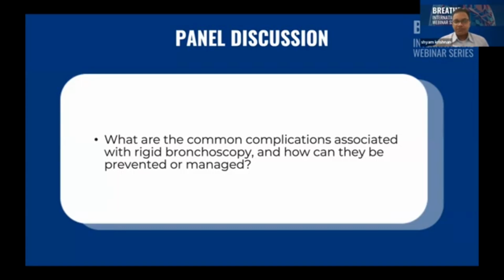So these are the common things. And if you're placing a stent, ensure the correct sizing of the stent, because if the stent doesn't open in the trachea, then we are stuck, because that can cause central airway obstruction again. Especially the silicone stent I'm talking about. Ensure that stent blockage doesn't occur. Patients with silicone stents, advise nebulization so that there's no mucus plugging, which causes stent blockage. So these are the commonly encountered complications, but when you proceed to do interventional procedures, you can expect these kinds of complications at some point or the other.